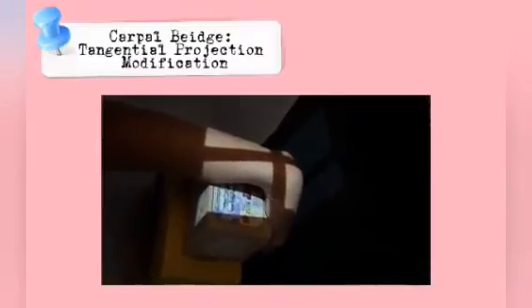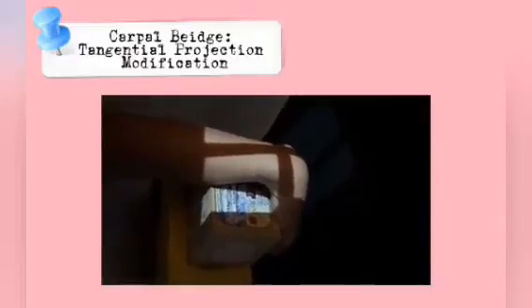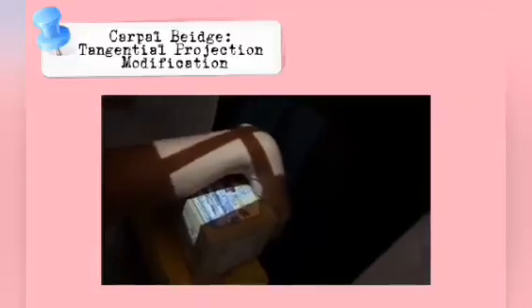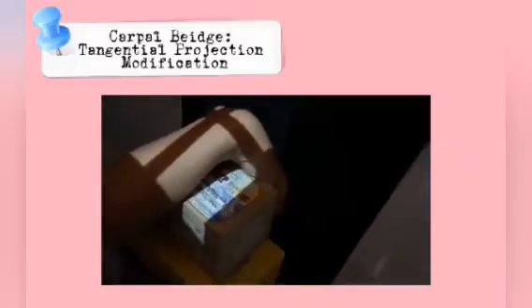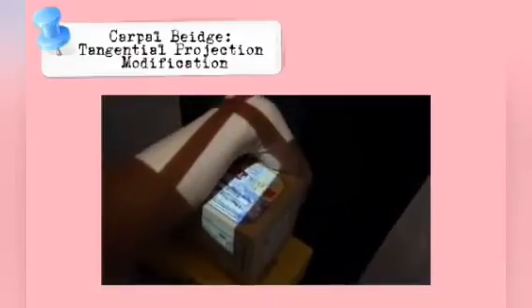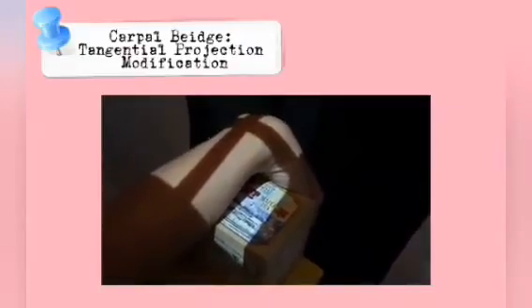When the wrist is too painful to be adjusted in the position just described, a similar image can be obtained by elevating the forearm on sandbags or other suitable support. Then with the wrist flexed in right angle position, place the IR in the vertical position. Shield gonads.